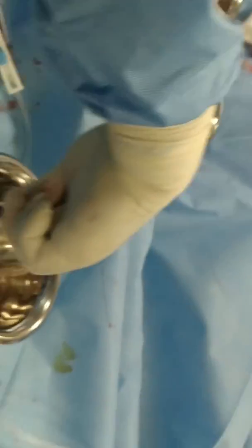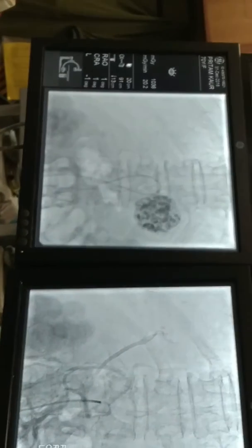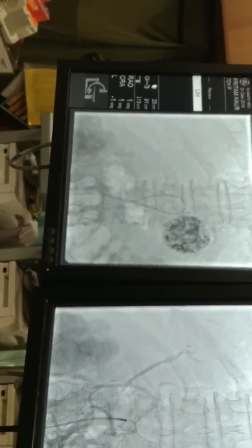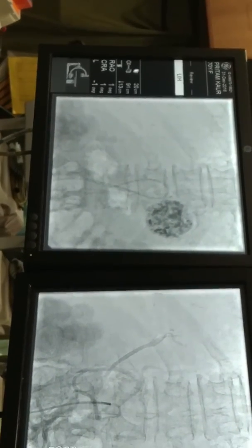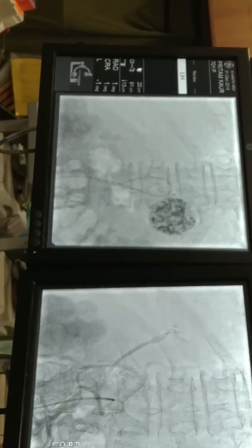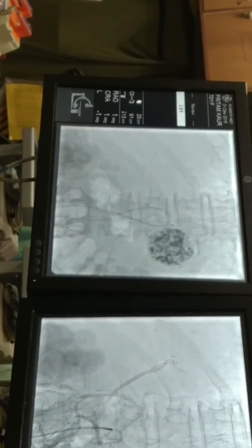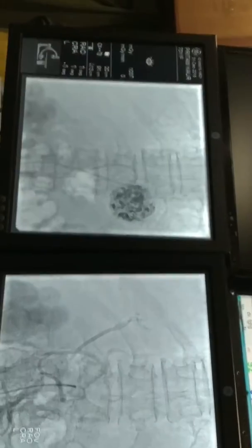There is some PVA remaining in the micro catheter, but I am not worried about it. See, this is the infusion — I have mixed it with lipiodol, whatever is left over. I am just putting it in. This is the common hepatic — see, it's showing. It's a little difficult to see because it's a little dilute, but we are not obstructing the arteries, so it's just an infusion.